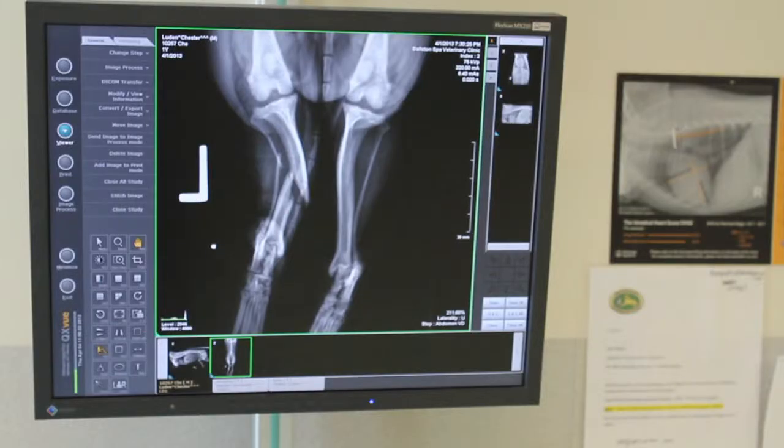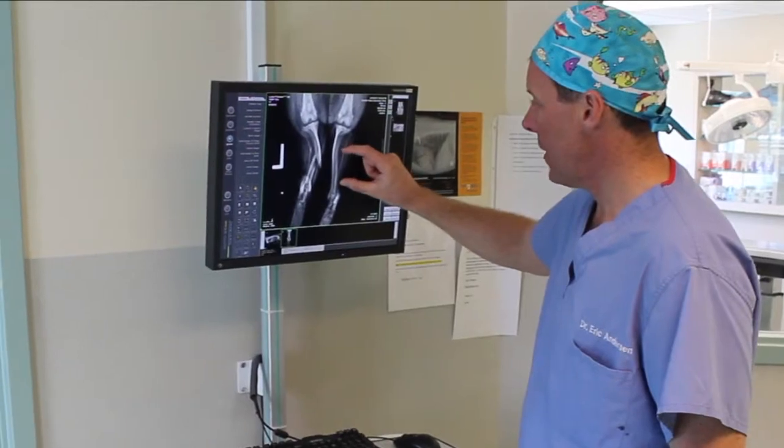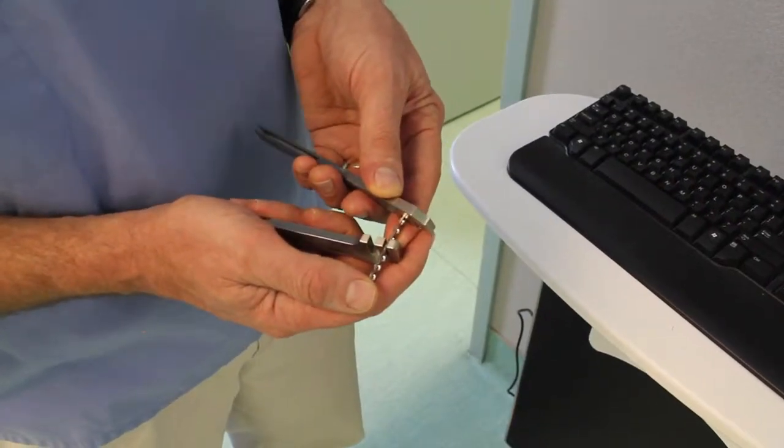Good quality x-rays are necessary for surgical planning. In some cases, Dr. Anderson will use the x-ray of the normal limb to determine plate size and length, and will even pre-contour the plate prior to surgery.